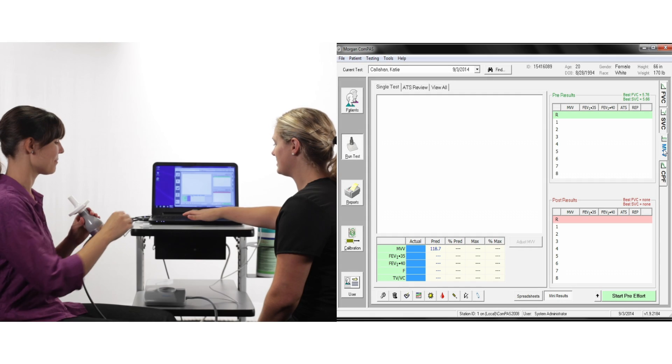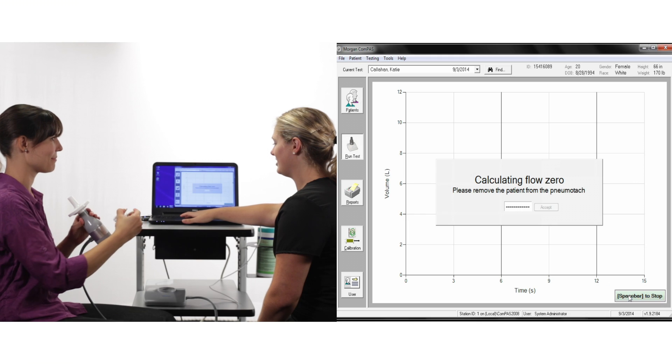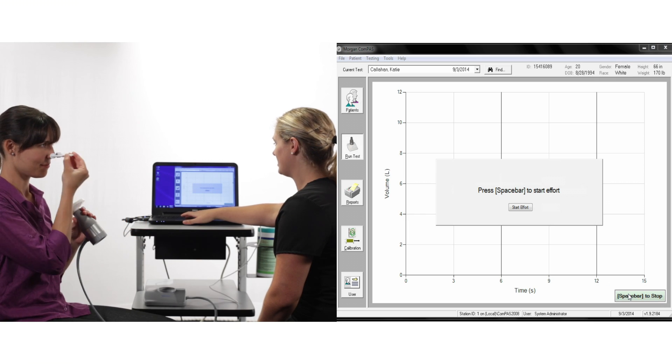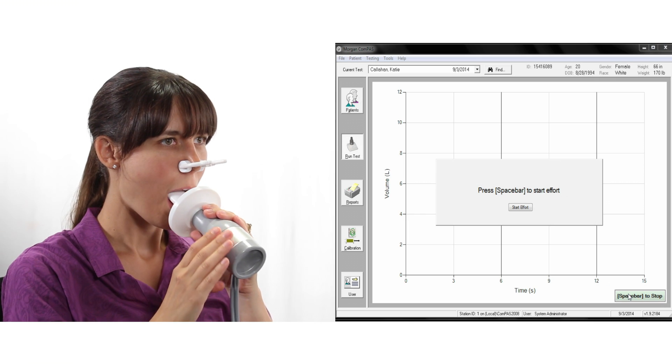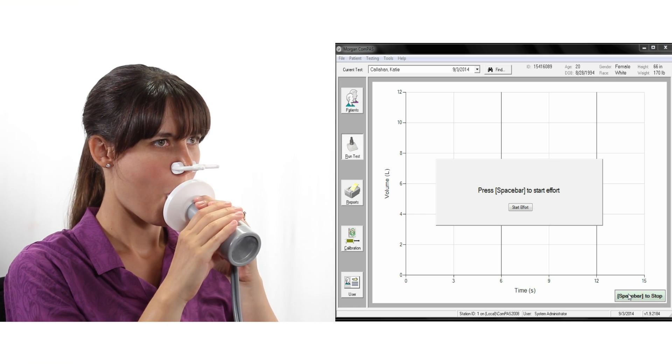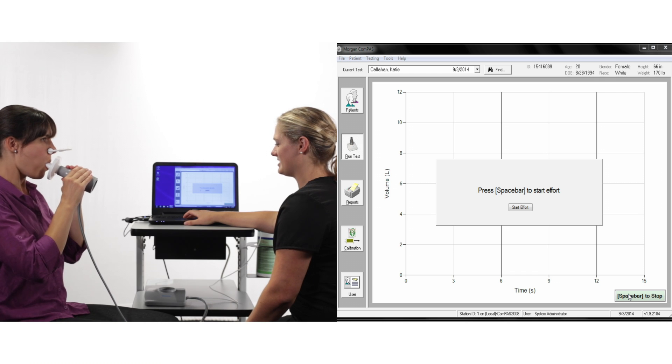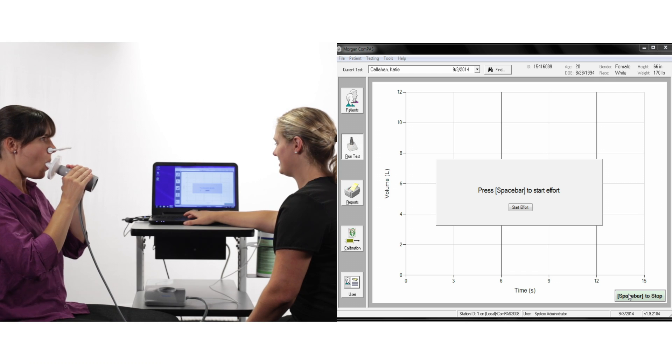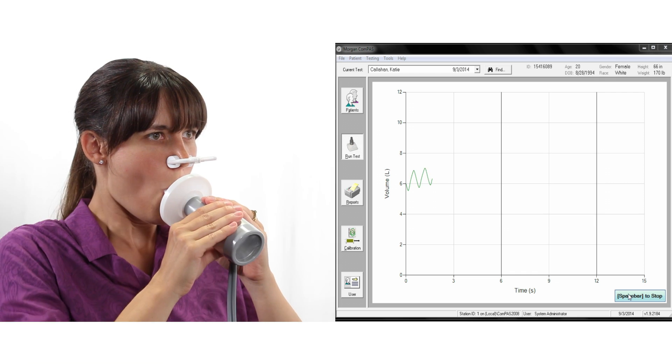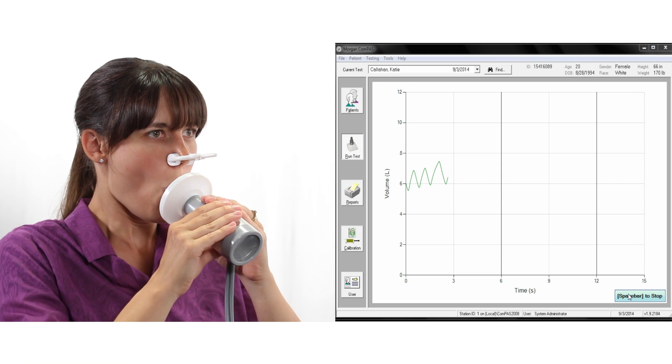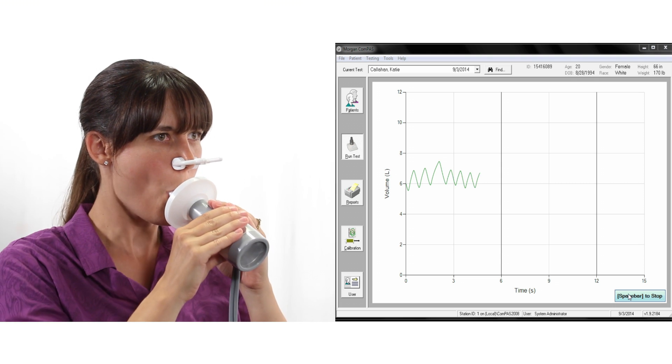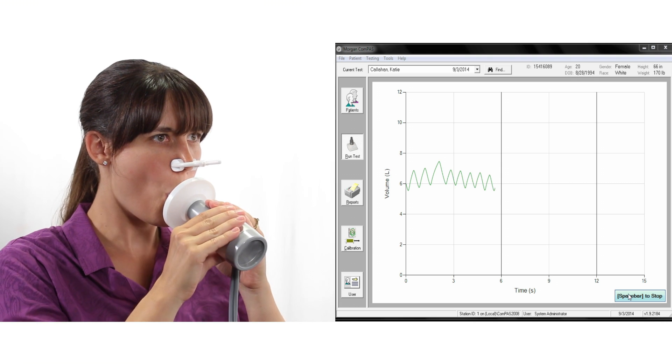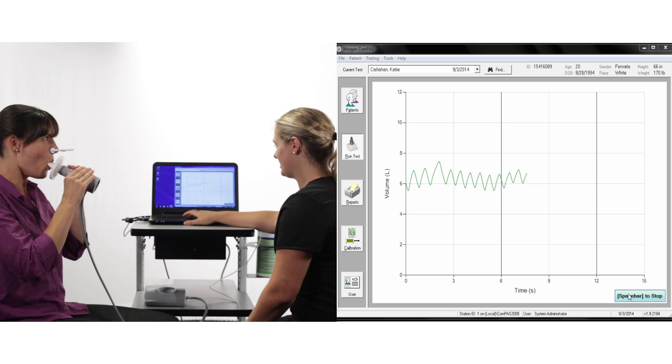To begin MVV, make sure the subject is sitting upright and is wearing the nose clip. Have the subject start the MVV effort and then immediately press the spacebar to begin the recording. Encourage them to breathe deep and fast and try to reach 15 seconds.